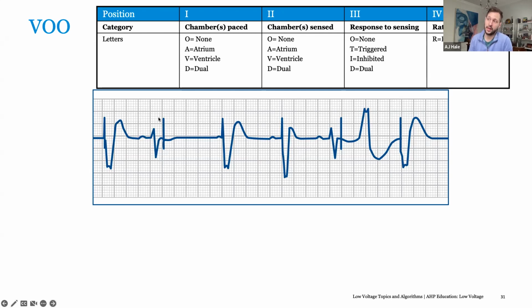Now, right here is a little odd. What are we seeing here? This is an EKG, and why are we not seeing an evoked response? Well, this is an intrinsic QRS complex, obviously. The device is set to not pay any attention to anything that's happening and pace no matter what. So it paces, and unfortunately it paces into a T wave, which is not ideal because this can be proarrhythmic, but it doesn't really know any better. It resets a timer, waits 1,000 milliseconds, and paces again.